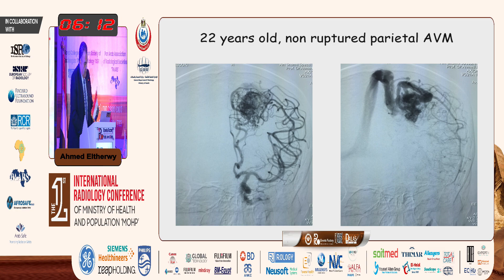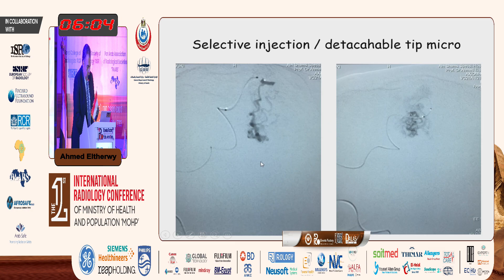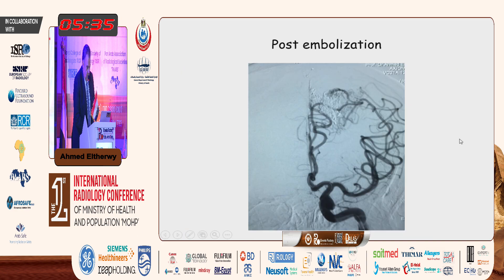This is a 22-year-old with an unruptured parietal AVM, seen here on AP and lateral views. This demonstrates the pressure cooker technique. This is the first micro catheter — a Sonic. We can see the distal marker of the Sonic and the two other markers, including the detachment zone. Here we can see glue injected forming the plug, and then onyx can be injected without reflux into the artery. This was the end result of this embolization.